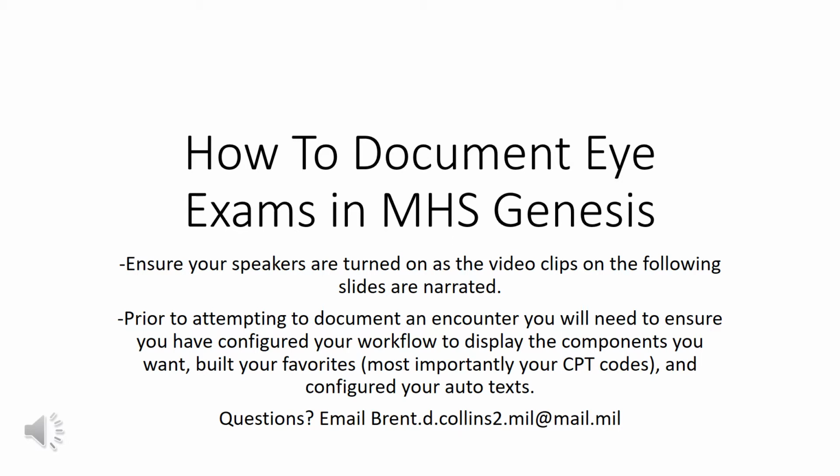This was developed independently to be an aid to new eye providers who are using Genesis, as I experienced many frustrations trying to learn it when I was first introduced to it. Please ensure your speakers are turned on as the video clips on the following slides are narrated.